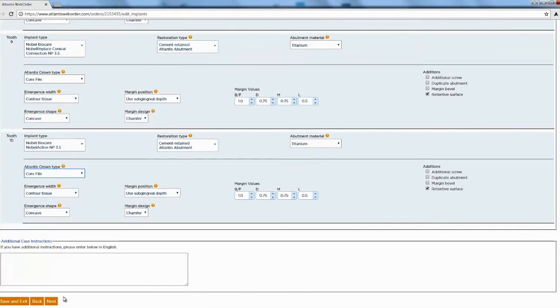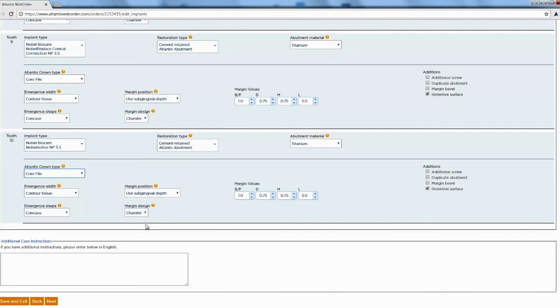Once you've done that hit next. You also have different margin values. They have a default but you can go ahead and set what you want your margins to be. And then also your emergence width, emergent shape, margin design and if you want any additional things as well.